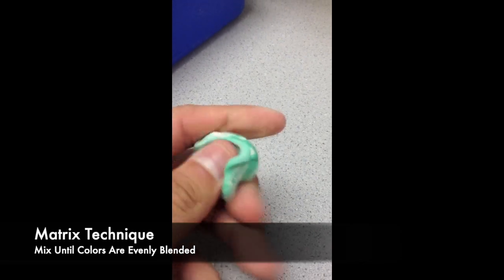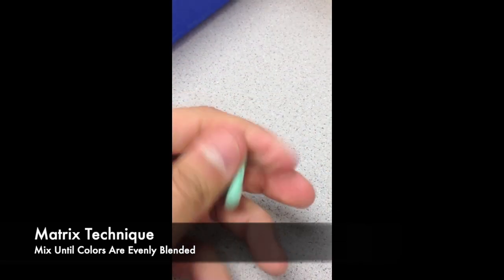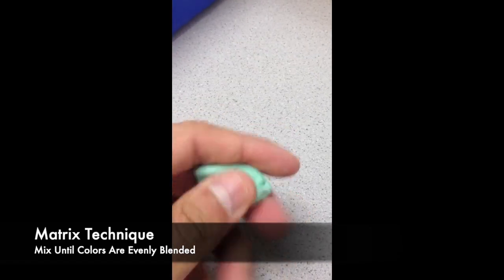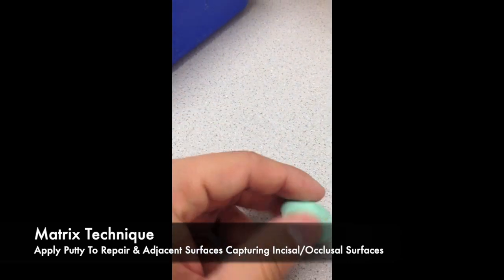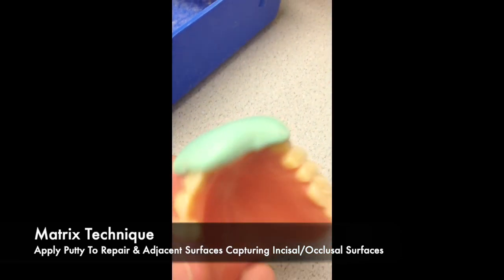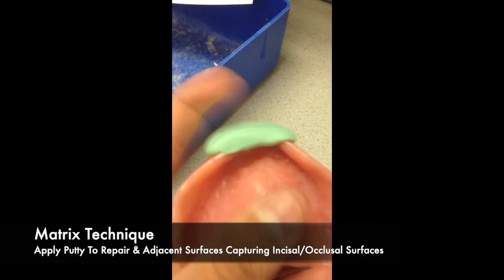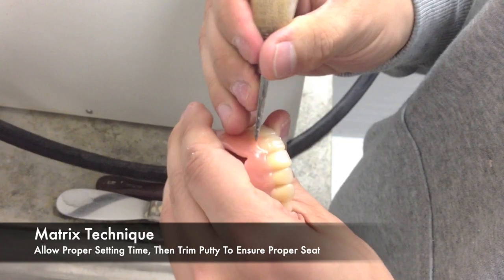Mix the base and catalyst together until the colors are evenly blended. Take caution that if you mix for too long, it will become a solid and you will have to mix again. Once evenly mixed and it has become one color, the matrix can then be applied to the repair area and the denture adjacent surfaces. Allow proper setting time, then remove the putty and trim to ensure a proper seat back onto the denture.